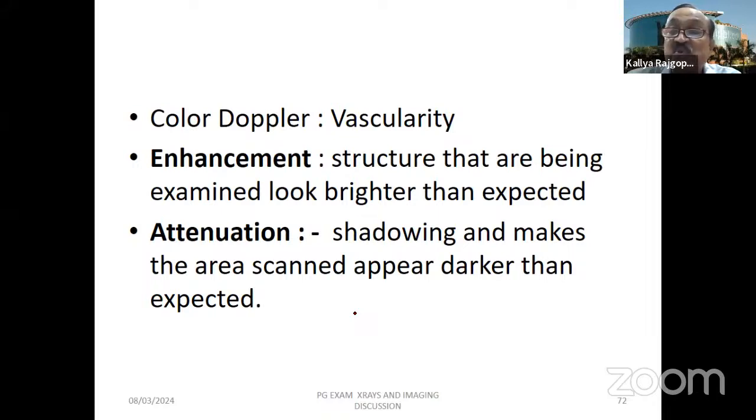Classical ultrasound of the scrotum for testicular torsion, of course, is aided by a duplex there. And you can also use it for intussusception, and gangrene. So this is one of the important uses of color Doppler.